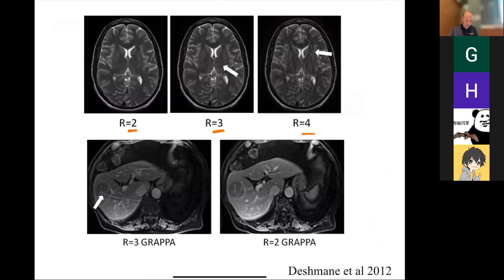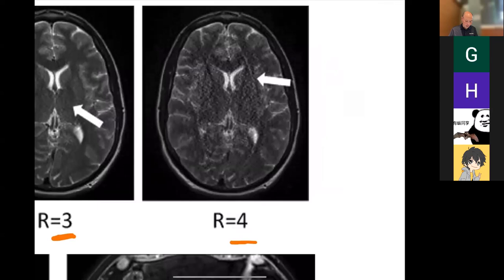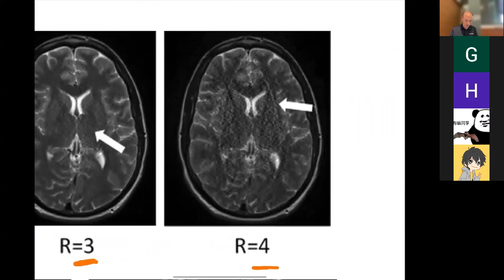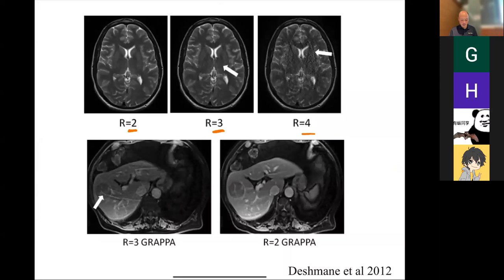You can see here, if I start to go too fast, there's more noise in this image, and you're starting to see some artifacts that aren't necessarily in the image. So there is a trade-off. Sometimes it's okay to go faster, but then you give up some image quality. When radiologists are setting up these protocols, they have to decide: is it worth going twice as fast? Can I still get the diagnostic images I need, or do I really need to go slower?